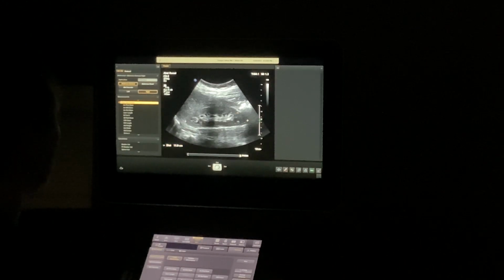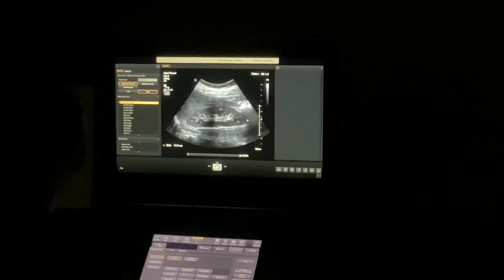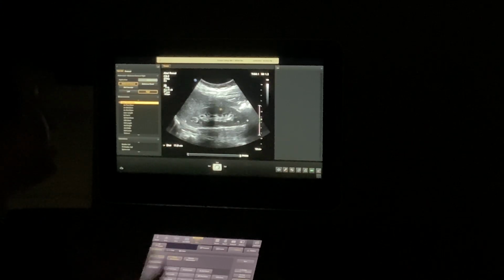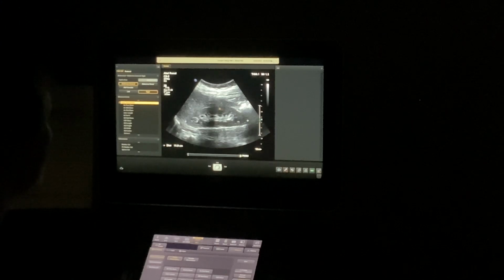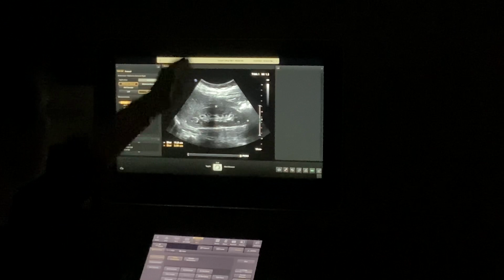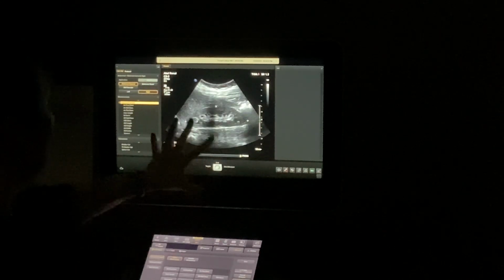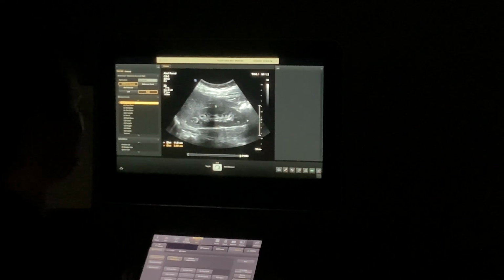That is your length. Now, when you're doing your height measurement, you can do it in trans because that is what is put on here. However, let me just say, take it where you can see it the best. Typically, transverse kidney is where you're gonna get the best height measurement. However, if you do not think you get clear margins, take it in this mid portion, okay? You can do it here to here. AP measurement, you want your kidney perpendicular on your screen. See how nice and straight I have it across the screen? That's what we're going for, and you're doing an AP measurement for height.